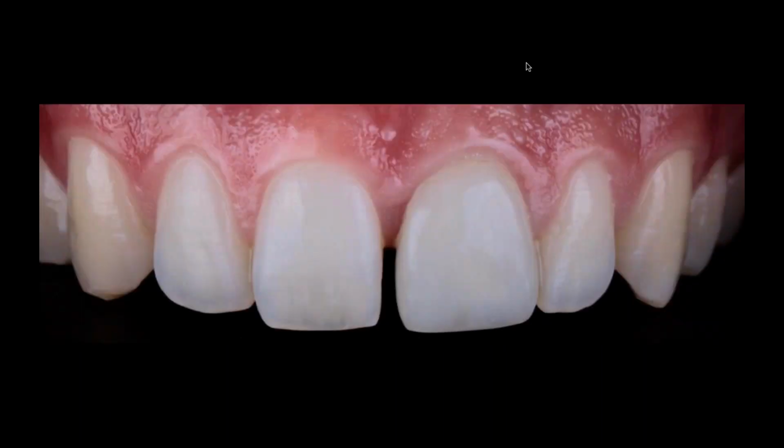So this is a very challenging situation for me. Young patient, close to graduate from Penn. He goes to us there, and he doesn't like 2 things. One, that over-contoured crown on number 9, and the diastema. But if we don't go through this analysis here, we use the DSD app, we are not really sure if what we can do is going to be something that will meet the patient's expectations.